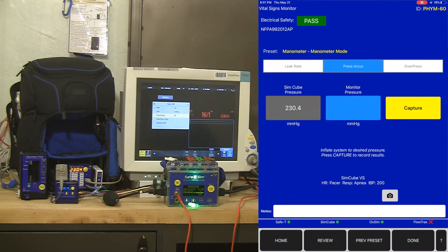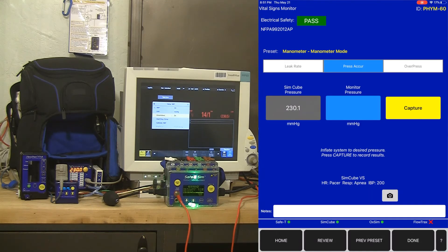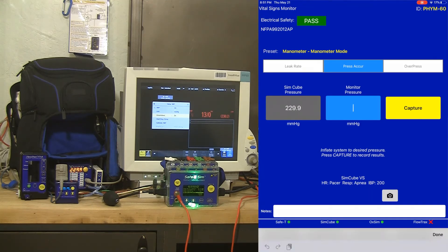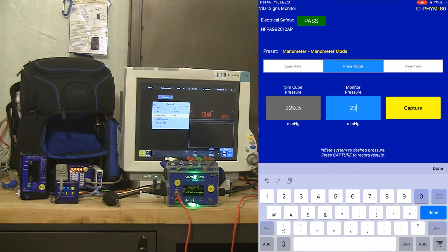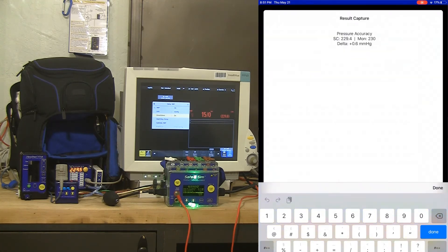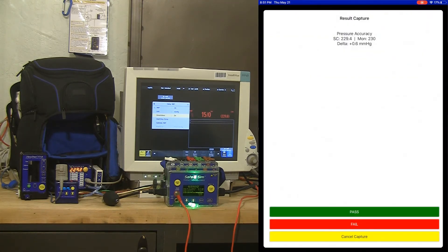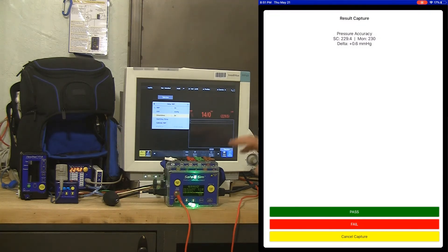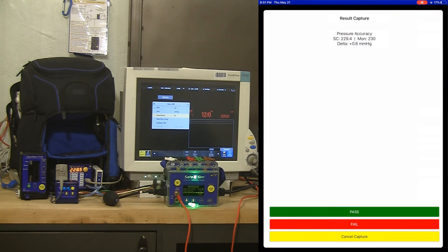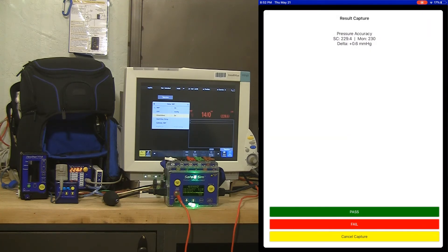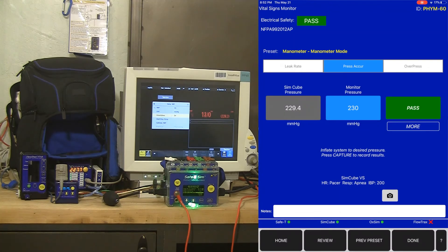So we've done a leak rate test. We can move on to pressure accuracy. I'm going to leave the system inflated at 230 millimeters of mercury or so and I'm going to type in the pressure seen by the vital signs monitor and hit capture. Now I've got a pressure accuracy result based on the SimCube manometer and the transducer in the NIBP circuit. On the capture screen we're actually showing the delta as well as both the SimCube pressure and the monitor pressure. So we can see a delta of 0.6 millimeters of mercury. So those two transducers are very close and we got a pass.